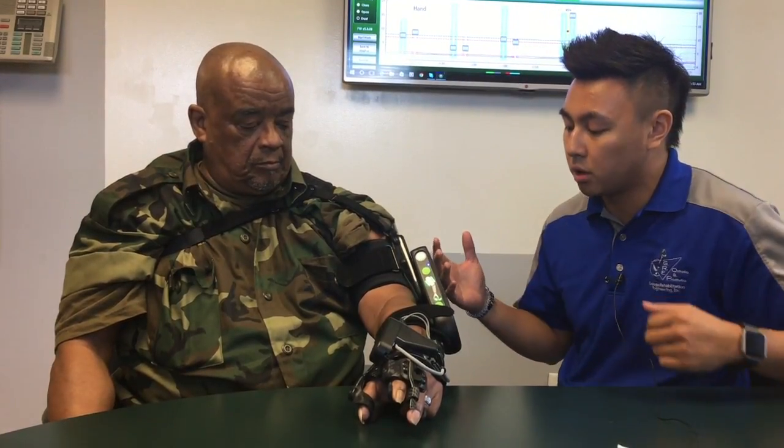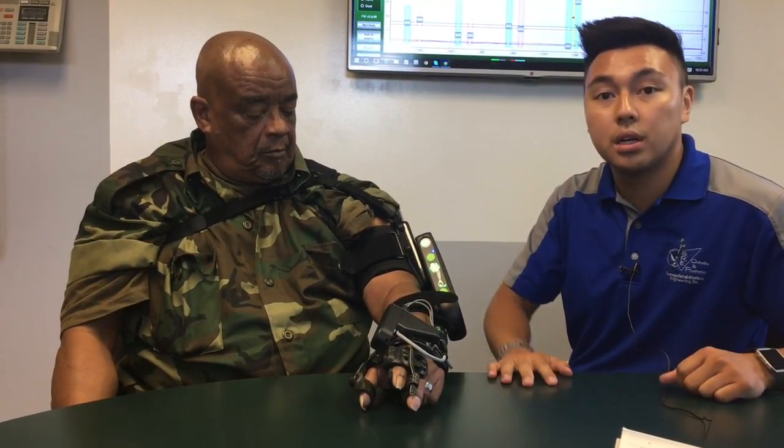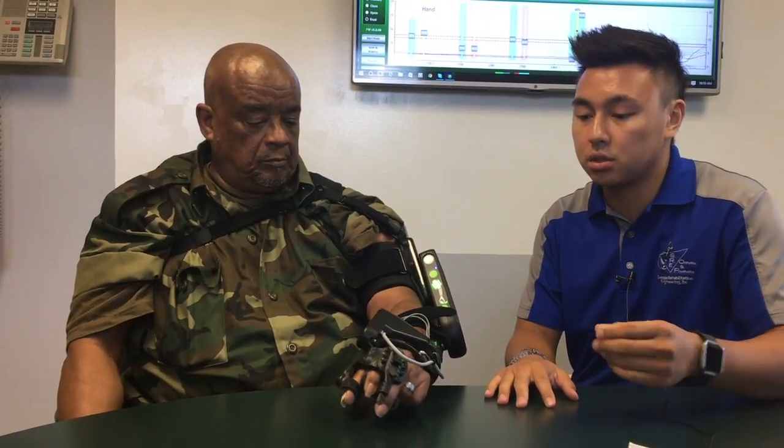Right here we have the MyoPro. Here's the control panel, and on his skin we have sensors that are going to read his muscle activity. How it works is by JJ here pretending like he's going to close his hand — JJ, close your hand — and now the device will amplify that movement and close it for him.